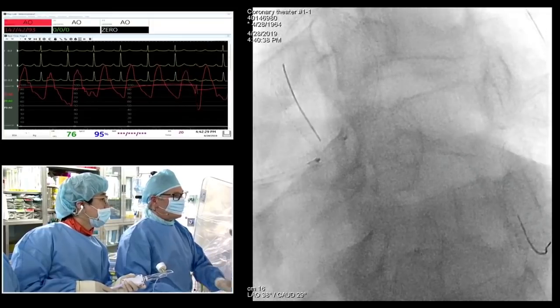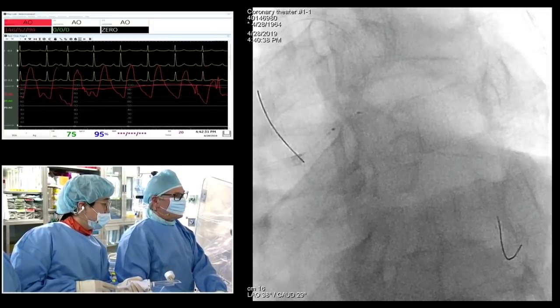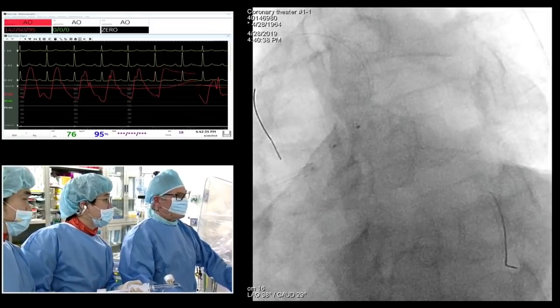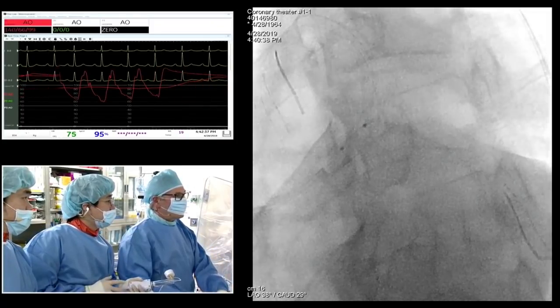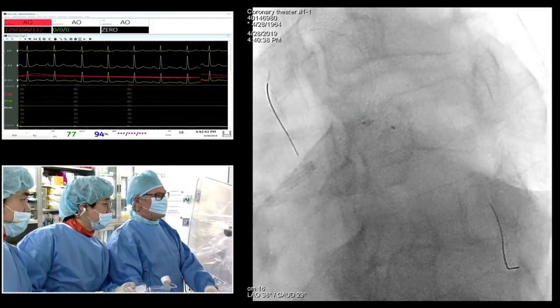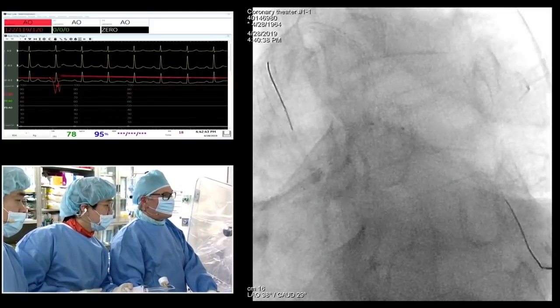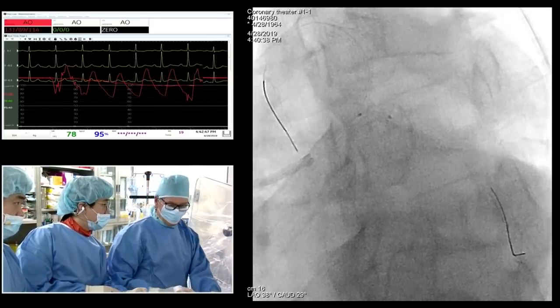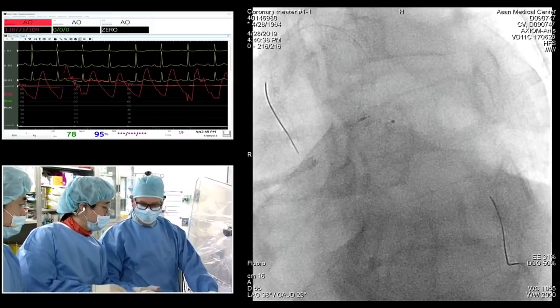Yes, but I do think not only, no, I think the stent expansion in general in the circumflex is okay by OCT, but at the ostium, I see the crush stent is like folding back to the circumflex. That's the reason we see 2-3 layers on the opposite side of the carina. So some sort of mechanical issue happened. Okay.